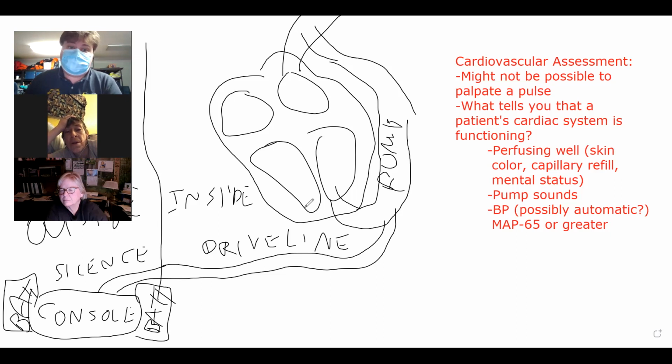And you should also, early on, contact the LVAD coordinator or the VAD coordinator to start a discussion on CPR. This is a very time-sensitive phone call that you will want to make, and you will want to explain what you have done to try to resolve the issue.